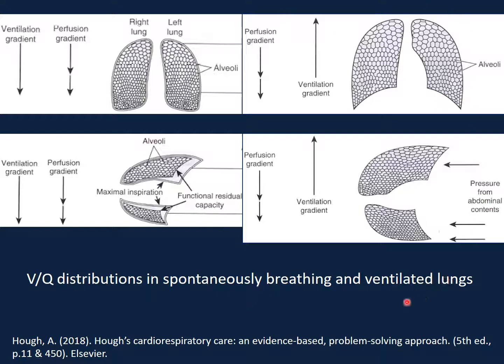When you look at the one on the right, this is a patient who is on mechanical ventilation. Okay, the diaphragm is not working as actively and therefore remains more dome shaped. If you look at all these little bubbles, they are quite small, and you have the diaphragm up here, and when air is being pushed in, it is harder to go into these places. So air goes through the parts of least resistance, and will go to the upper regions first. So you probably get more ventilation in the upper region for someone who is on mechanical ventilation.